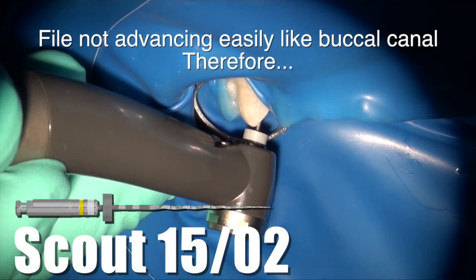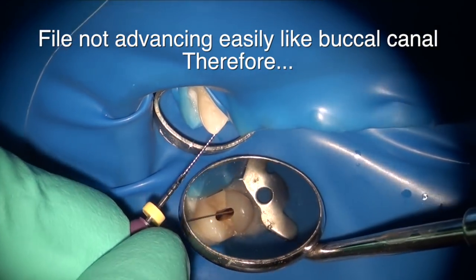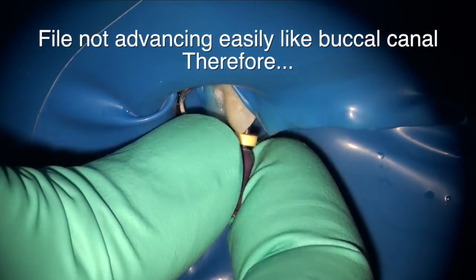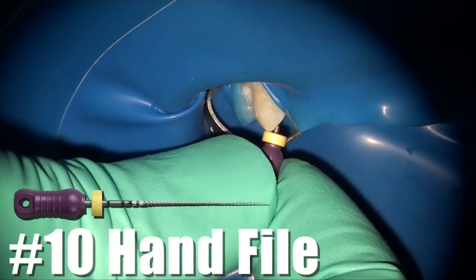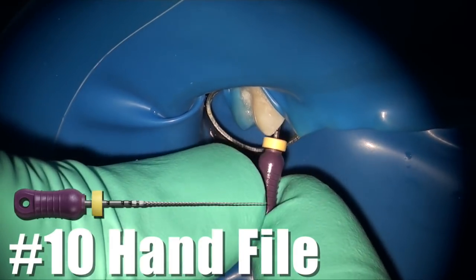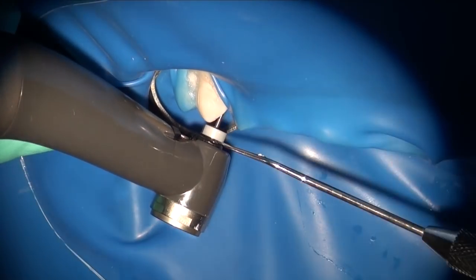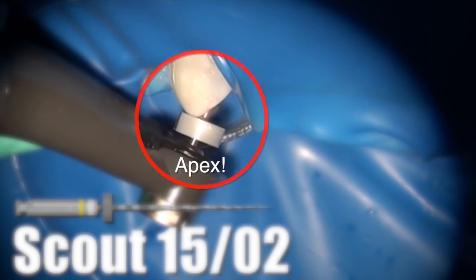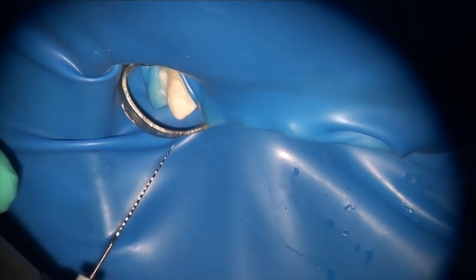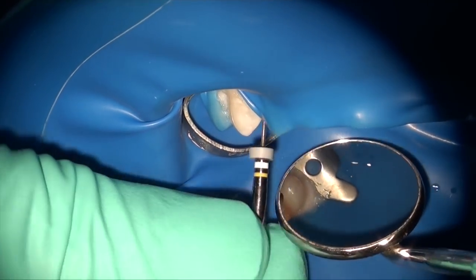On the lingual, however, it feels like I'm hitting a little bit of an obstruction at about 23 millimeters. That means it's time to do some hand instrumentation — instead of pushing my rotary file, I stop and use a pre-curved hook number 10 hand file to create space. Once I gain that space, I then proceed to use my Scout 1502, and as you can see, the Scout 1502 follows that hand file easily and enlarges the canal to a size 15 very quickly. I take the 1502 and get my working length there.